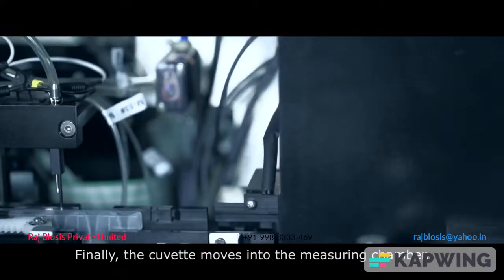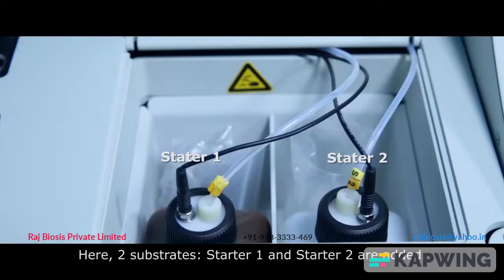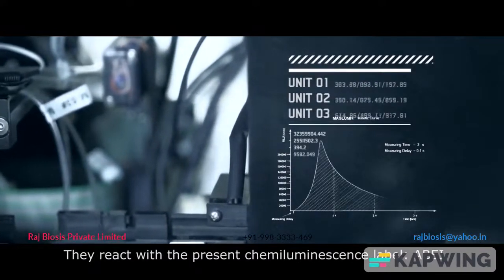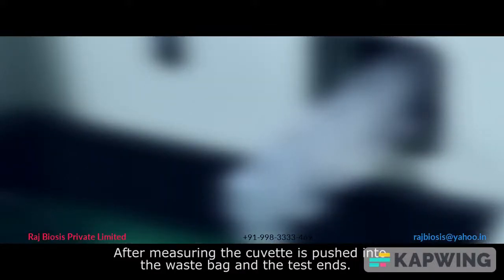Finally, the cuvette moves into the measuring chamber, which is a dark room environment. Here two substrates, Starter 1 and Starter 2, are added. They react with the chemiluminescence label ABEI. After measuring, the cuvette is pushed into the waste bin and the test ends.